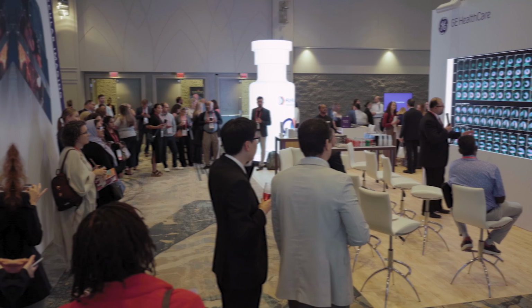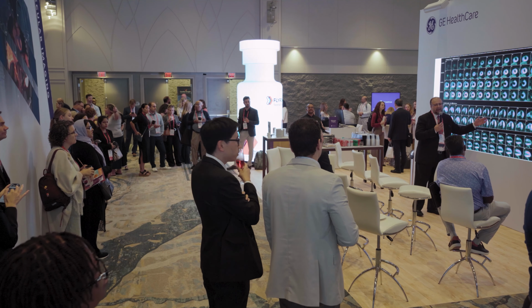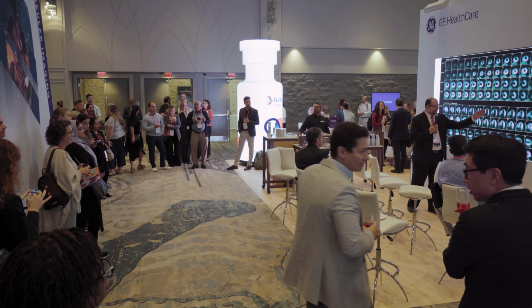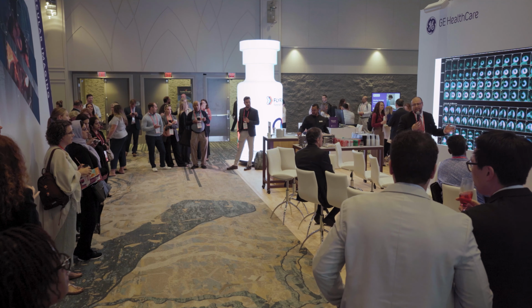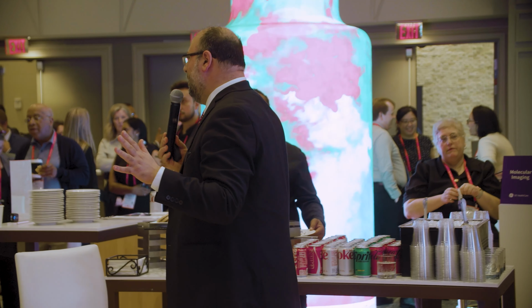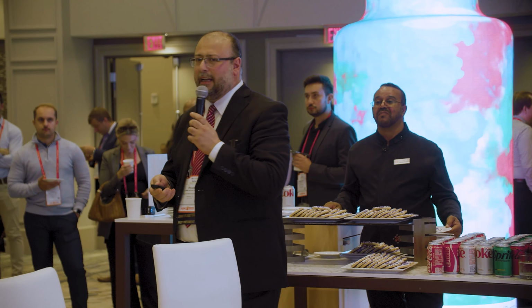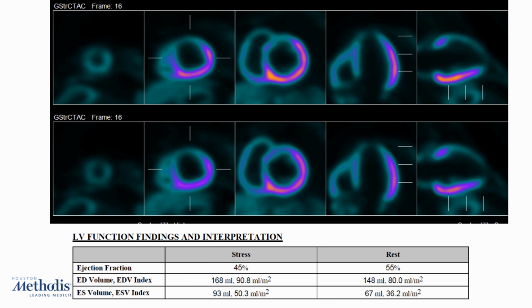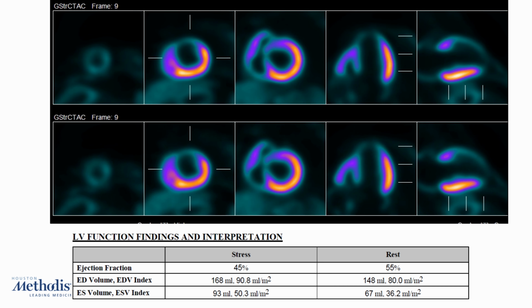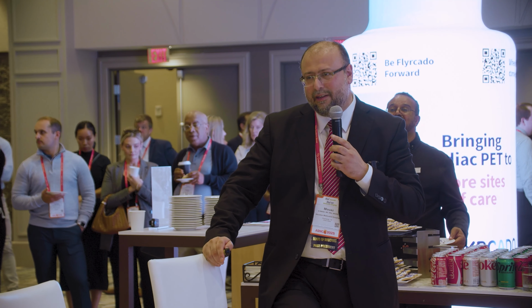So the area is perfused, but remember now you're looking at relative perfusion. So with relative perfusion, they look okay, but if there is disease in there, you're seeing the worst segment. So I'm still not sure based on just relative perfusion whether I'm dealing with single vessel or multi-vessel disease, and then I have to gather more information. So now looking at gated images, there is a 10% drop in ejection fraction, but the ischemic perfusion defect was also big. There was significant TID there. But it is expected with this large perfusion defect that you see.